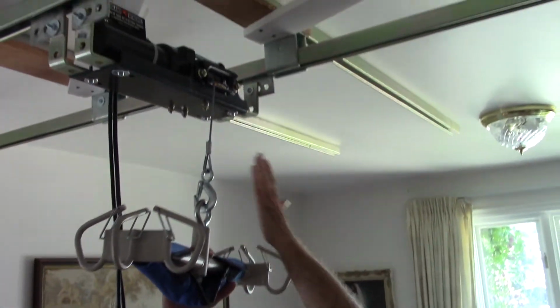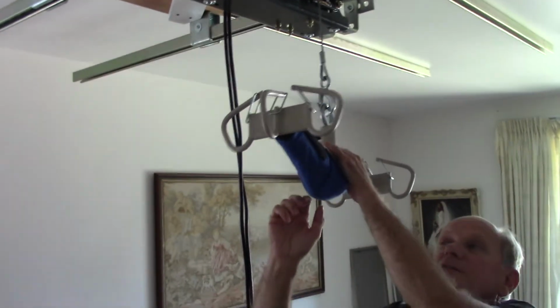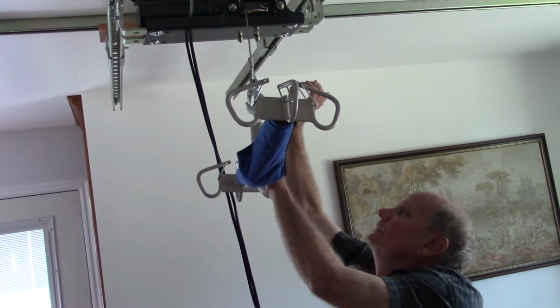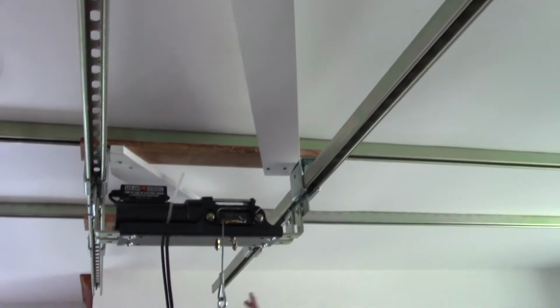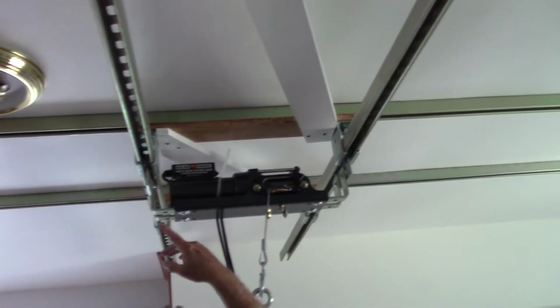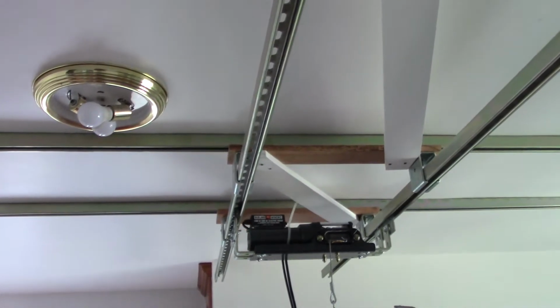So we've gotten these level, or parallel exactly, by running it back and forth and then screwing up into the trusses as we go along. I think I actually used this one as the main one and then put those 2 parallel to it by running it back and forth. The board at the top, and they're not even the same widths, you might notice. We just got 3 boards, but we drilled them together so that we got these bolts that run up into the other wheel exactly the same distance apart on each of them. Then we have the ability to run the winch back and forth.